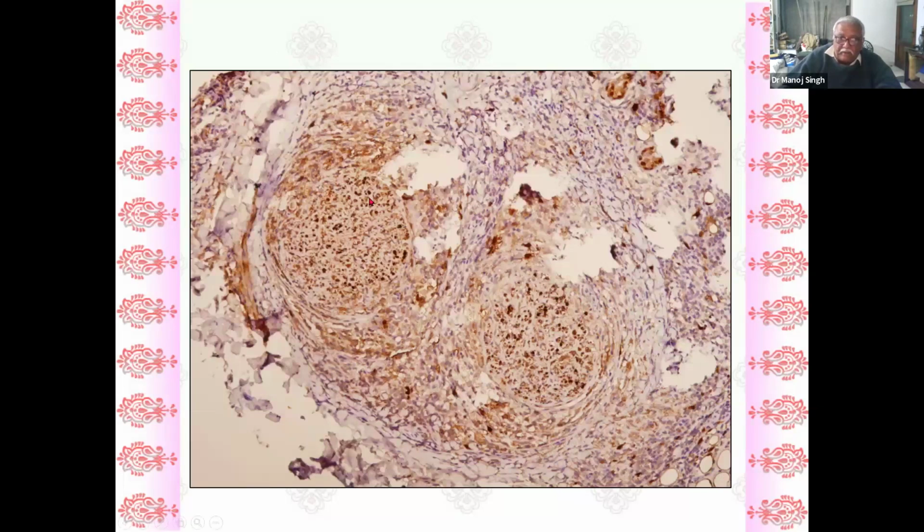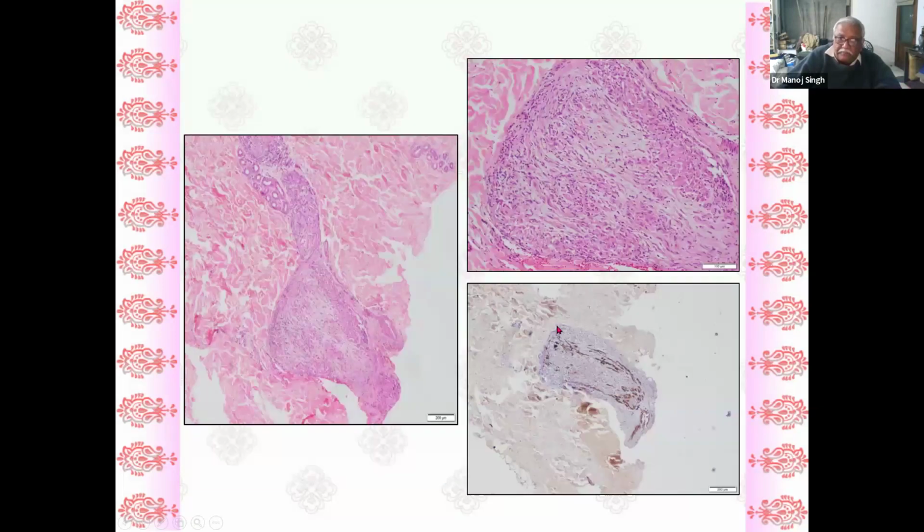Again, you're seeing here preserved nerve here, destroyed nerve here, and this is the type of thing which you at times see in the dermis. Only this, you do not have the nerve twigs because they've been destroyed. And a nerve which has undergone edema inside the nerve. And you can see that very few of the nerve twigs are preserved. The rest of it is necrosed, gone.